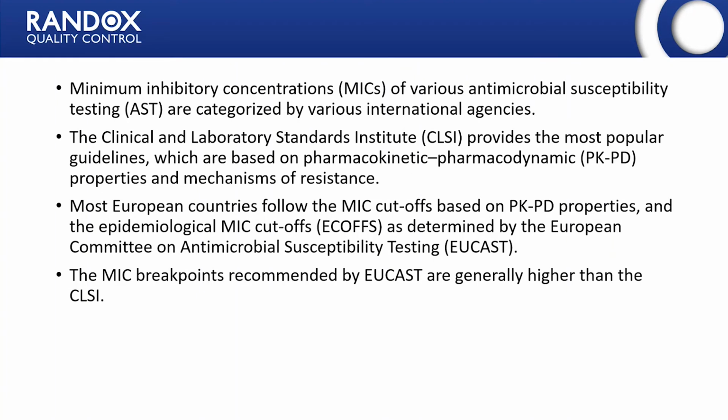because we had labs that were reporting this I for the intermediate level, which apparently now doesn't exist. Sorry, I'm going to get this wrong. It wasn't that the I didn't exist. It was that none should be down for susceptible. It should only be resistant or I. You shouldn't have any susceptible results for this particular antibiotic, which is what we had.